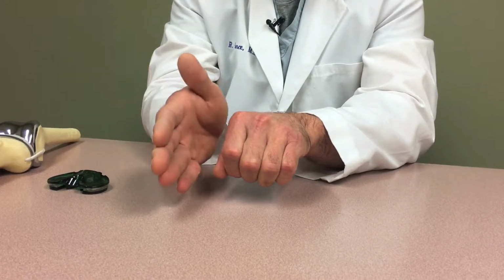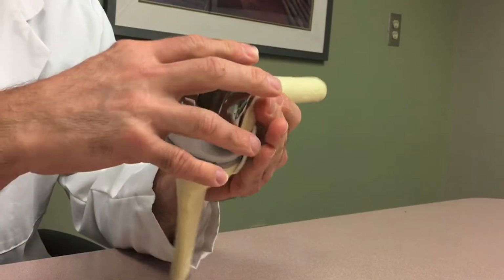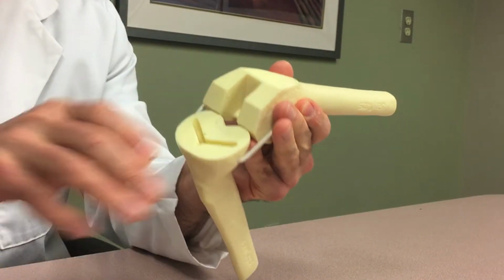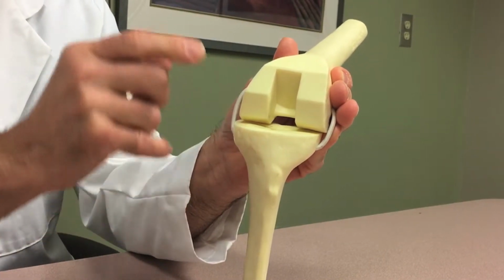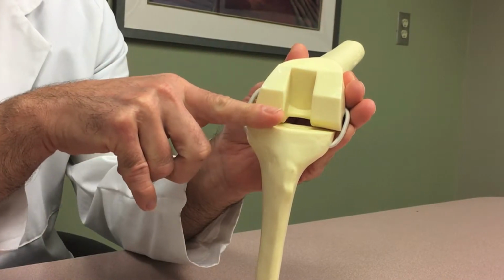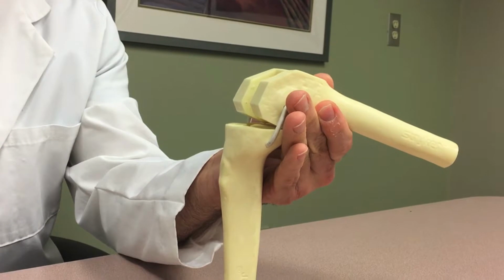So I thin the kneecap out, and that gives me a lot of room to work with the femur and the shin bone. Knee replacement is a very bone preserving procedure. What we do in a knee replacement is, here's the thigh bone or the femur, here's the shin bone or the tibia. On the femur, we just take little wafers of bone off the end of the thigh bone just to reshape it to match the geometry of our implant.